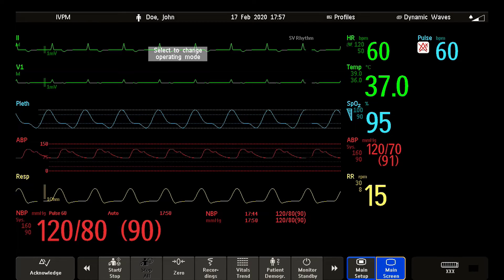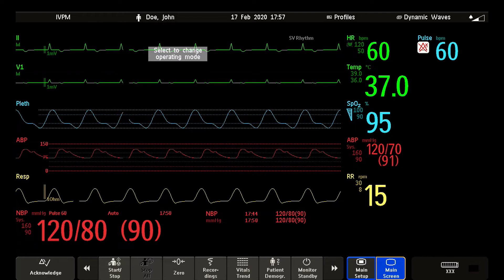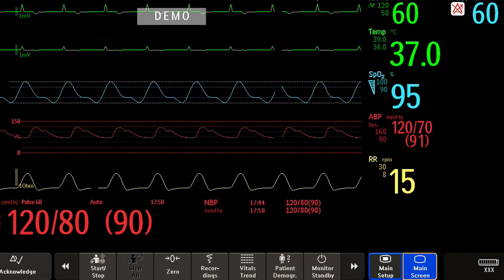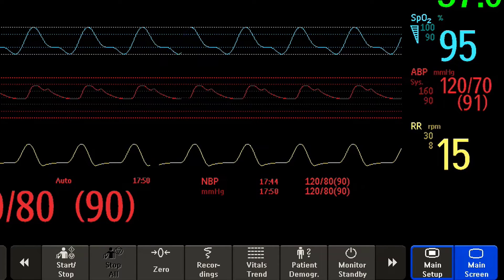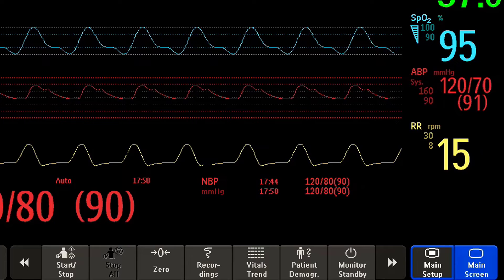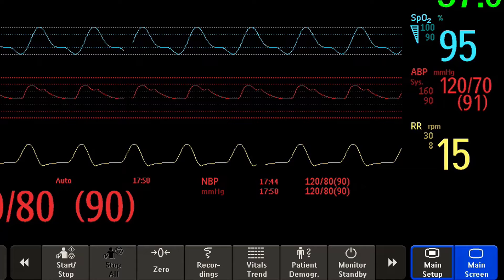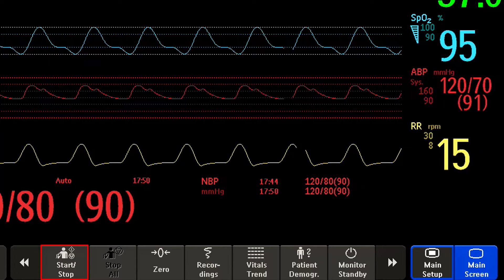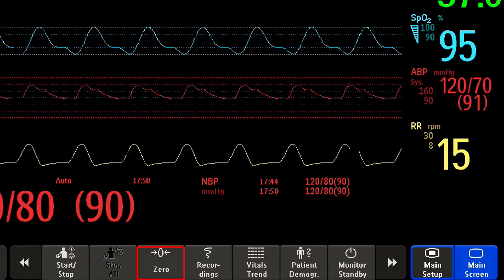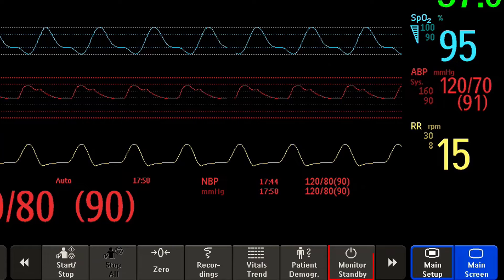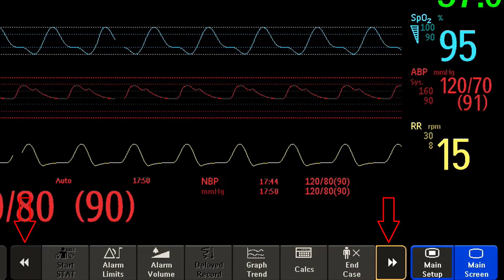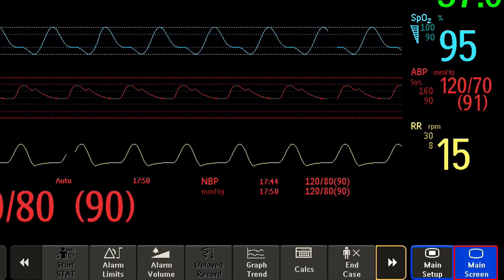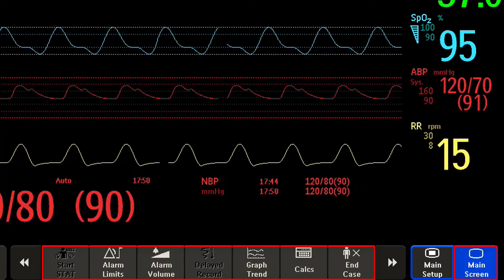I would like to tell you a bit more about our screen keys. Smart keys give you fast access to functions. The selection of smart keys available on your monitor depends on your monitor configuration. Here are some examples of common smart keys: start or stop a non-invasive blood pressure measurement, zero an invasive pressure measurement, view trends, or put the monitor in standby mode. Scrolling left or right reveals even more smart keys. Using the main screen key closes any open windows and returns the smart keys from the first row.